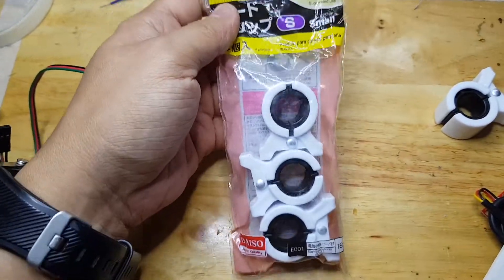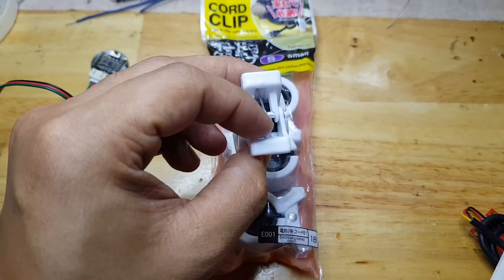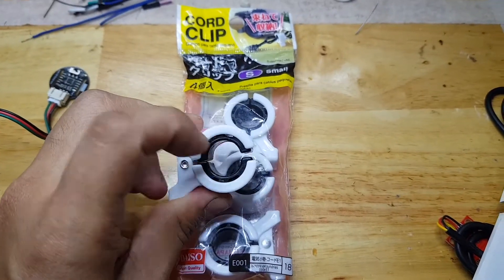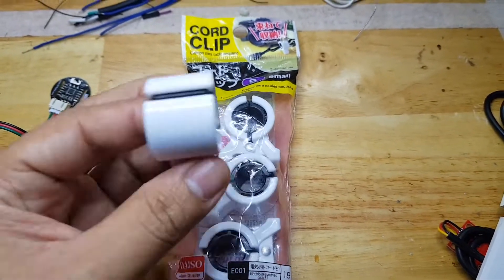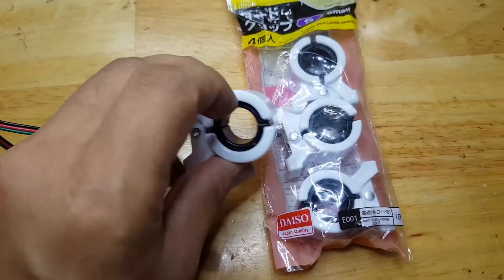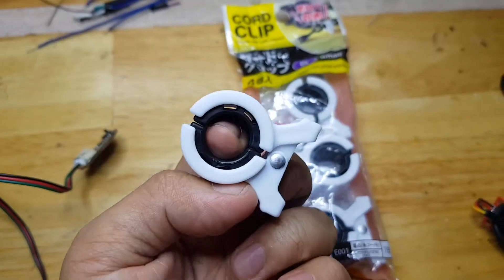This will be my alternative solution to that. This is a cord clip. As you see, it has a spring here where it will force these two parts to meet together so that I can squeeze my finger here. So my plan is to put this heart rate sensor there so that I can just put my finger and then clip it like this.